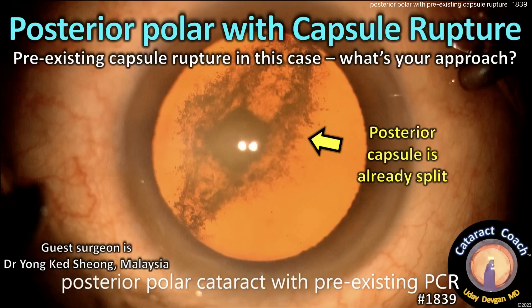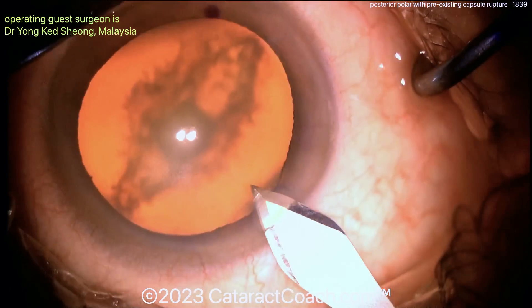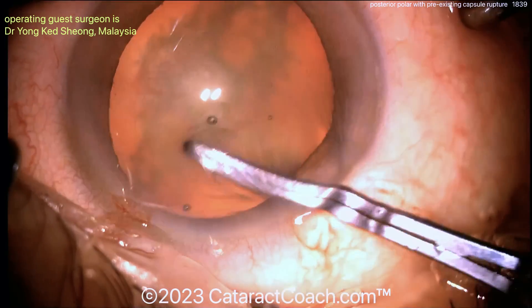cataractcoach.com — posterior polar with capsule rupture. Pre-existing capsule rupture in this case. What's your approach? There's the posterior polar opacity and a big rip right through the posterior capsule. That haze that's formed there is the lens becoming opacified because of its exposure, because the capsule is wide open.